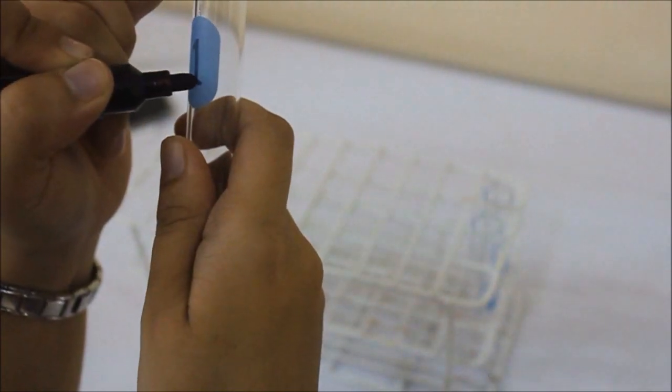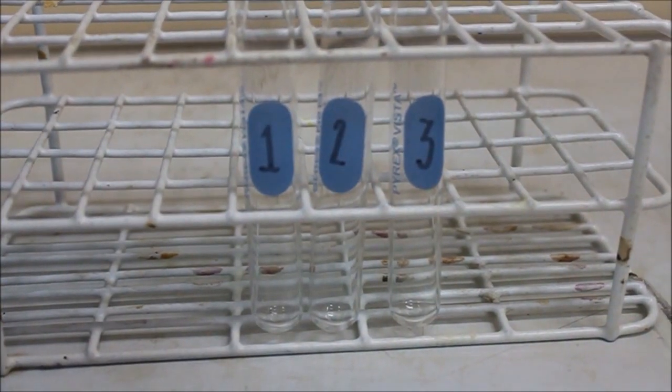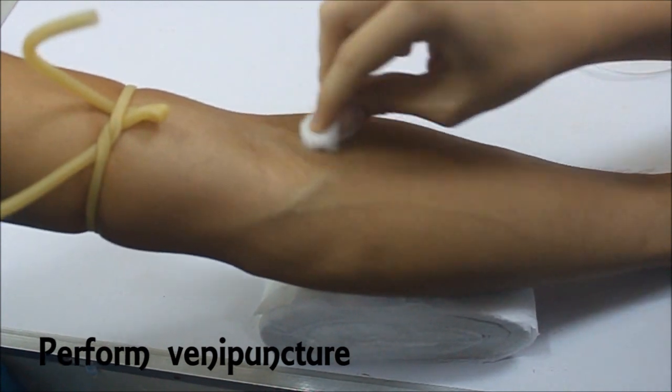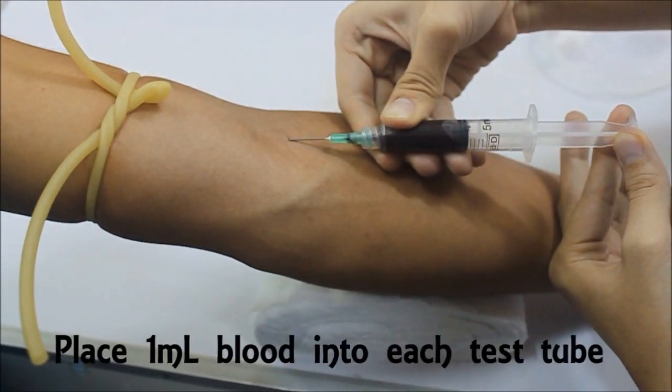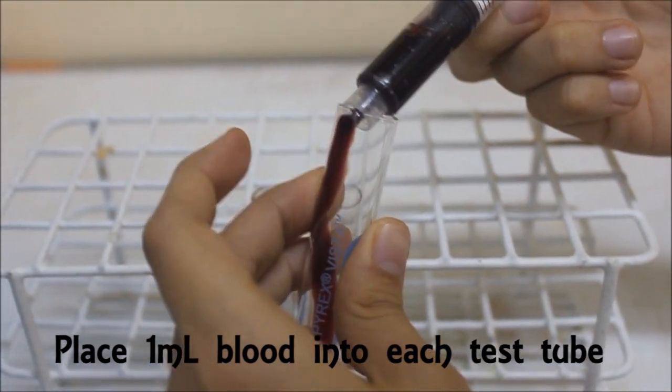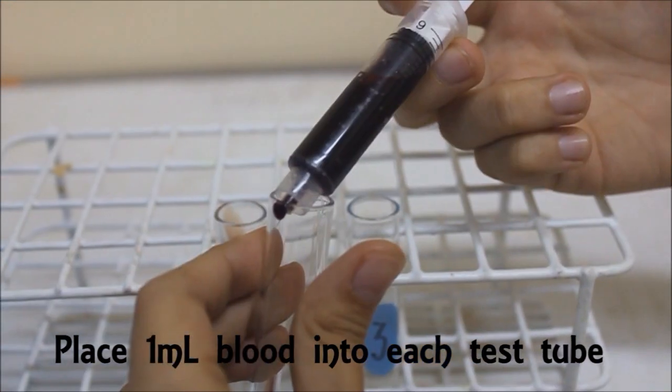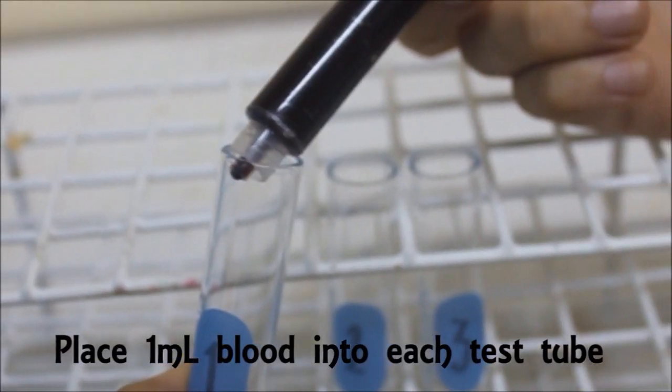First, prepare three clean test tubes and label each as test tube 1, 2, and 3. Perform venipuncture and collect 4 mL of blood. Carefully place 1 mL of blood in test tube number 3, in test tube number 2, and in test tube number 1.